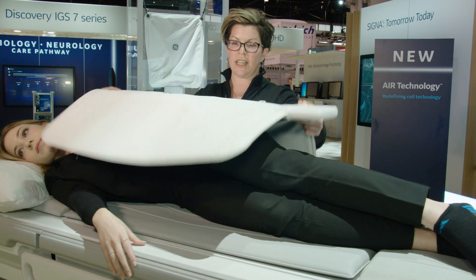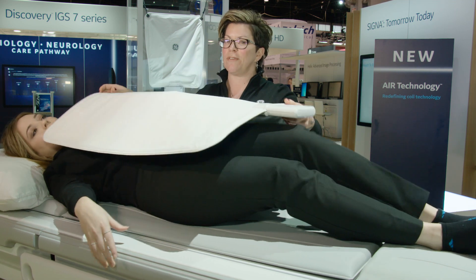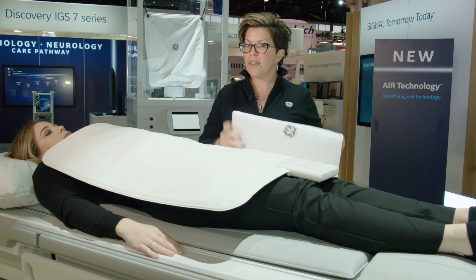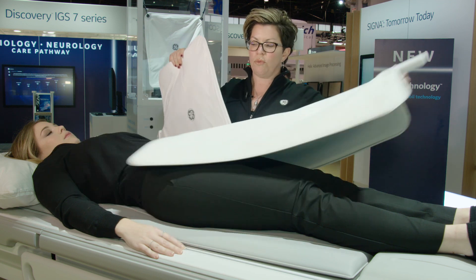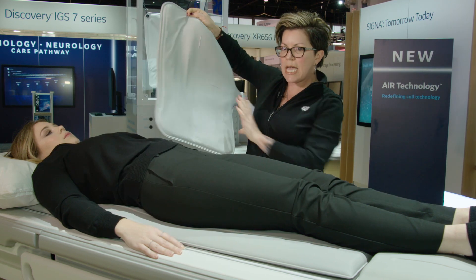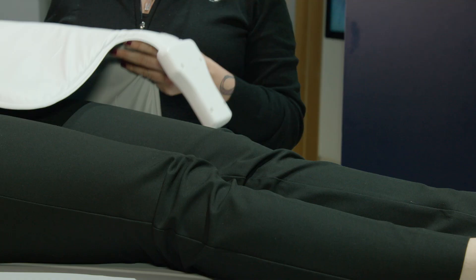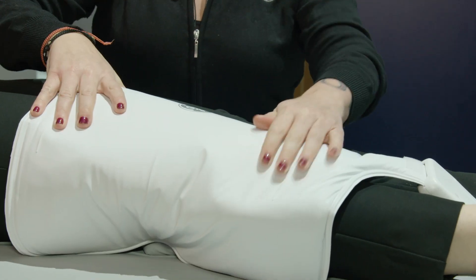She was someone that couldn't lay on her back — she can lay on her side and we can image that way, which is really great for pregnant patients or post-surgical lumbar spines. That's not the only coil in our portfolio; we also have medium and large sizes, helpful for cardiac or pelvic imaging. We can also wrap it around any joint for MSK imaging as well.